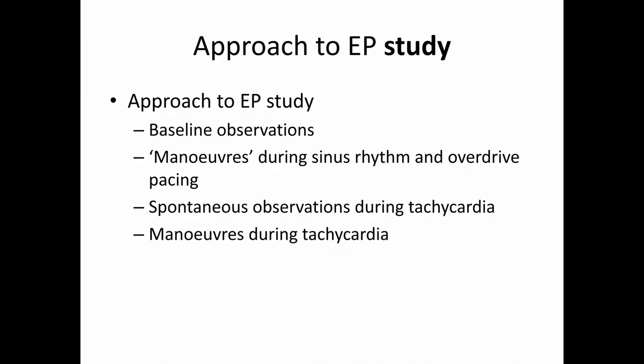And in general, what we're going to do during our EP study is, first of all, look at our baseline observations, do some simple maneuvers during sinus rhythm and overdrive pacing, our retrograde and antegrade curves, have a look for spontaneous observations during tachycardia, and then perform some maneuvers during tachycardia.